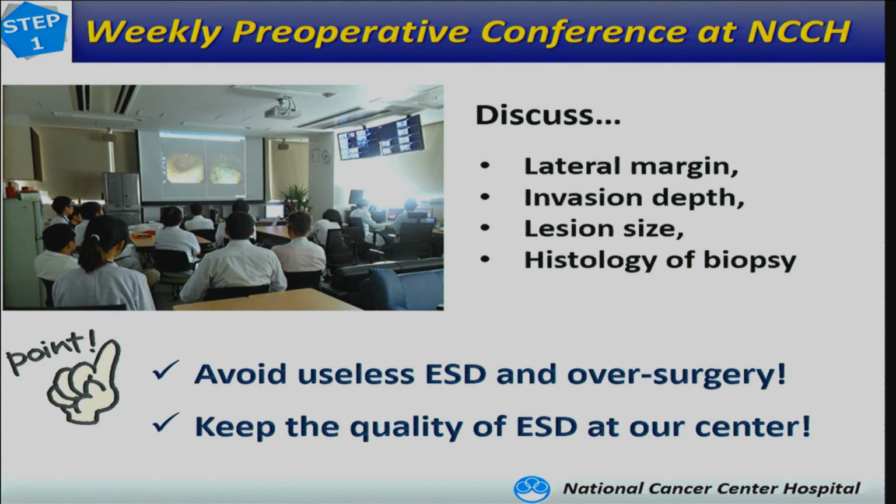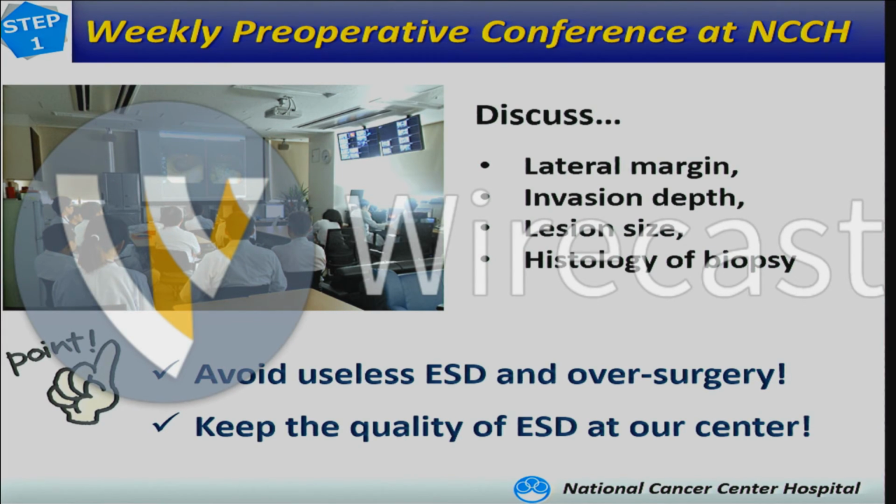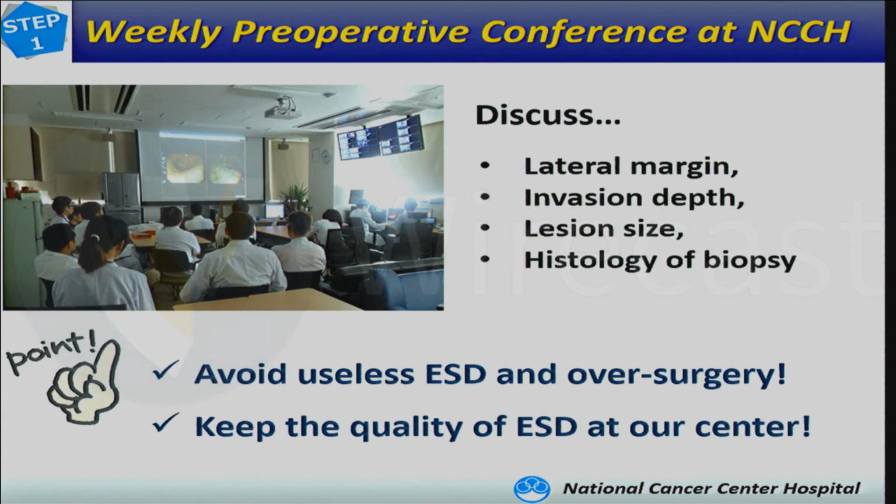And also, we have a weekly preoperative conference at NCCH. We always discuss the lateral margin of the lesion, invasion depth, tumor size, and histology of biopsy, and then make a treatment plan for each patient. So it is also a very essential process to avoid useless ESD and over-surgery and keep the quality of ESD at our center.